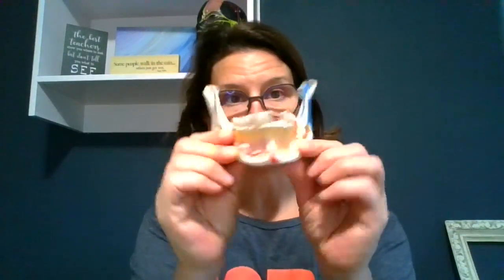The incisive injection would work well for Mr. Skull because that lateral and central incisor — numbers 24 and 23 that are missing — could definitely benefit from it. Our incisive injection is going to anesthetize the incisive nerve as it travels within the mandible. That incisive nerve junctions at the mental foramen, where the mental nerve exits the mandible and takes care of the cheek and chin, but the incisive nerve stays in and takes care of the pulp from the premolars to the midline.